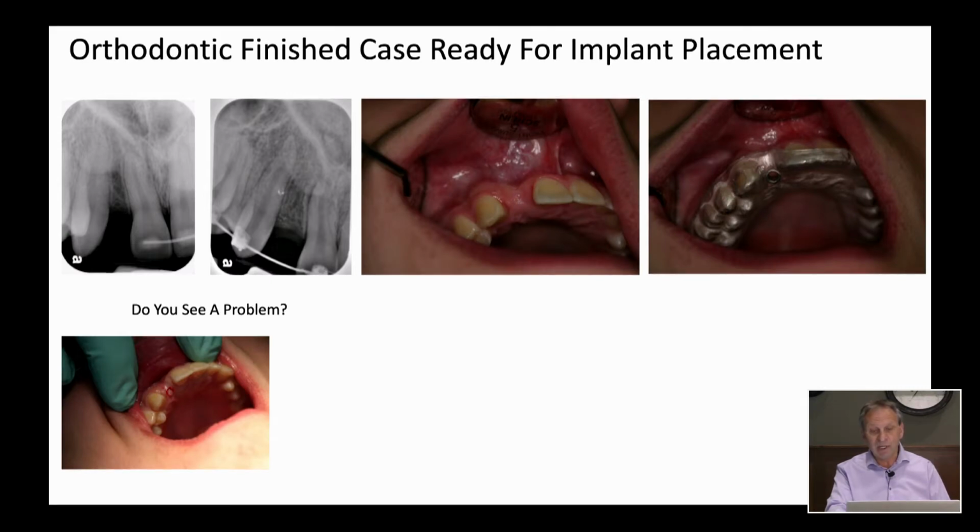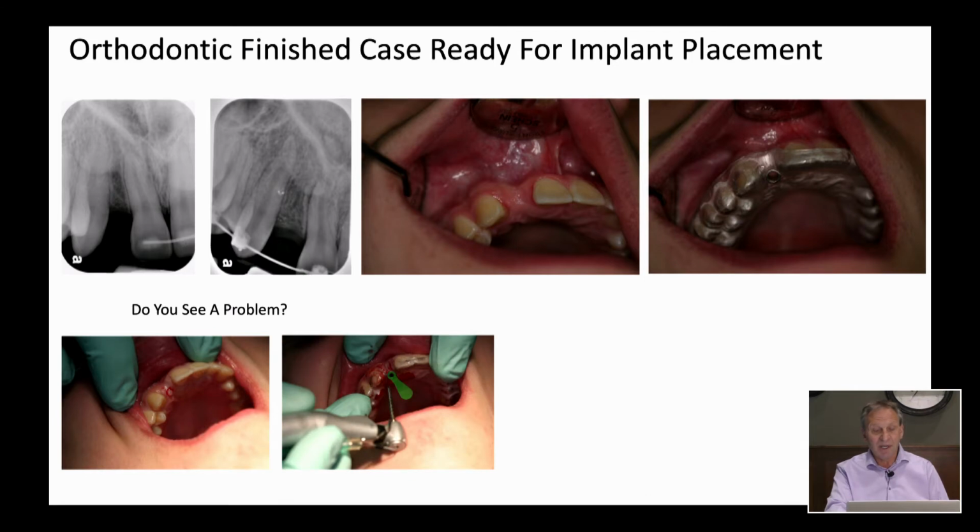So it's going to take a small diameter implant, but you can also see in that situation there is no room for error. So this would be an ideal case, even if it's a single implant case, even years ago, which this was, is to do guided surgery. Because you don't want to hit the roots of the adjacent teeth. You want to idealize the placement position as best you can. So that's the concept of guided surgery, and guided surgery works.